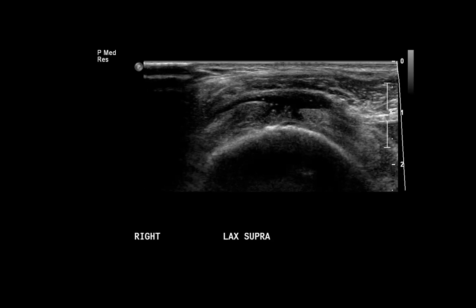Here we have an ultrasound image of the right shoulder. Some of you may not be familiar with musculoskeletal ultrasound, but this is a very effective way to evaluate the shoulder and particularly the rotator cuff. Here we have an image of part of the rotator cuff on this diagnostic ultrasound image.